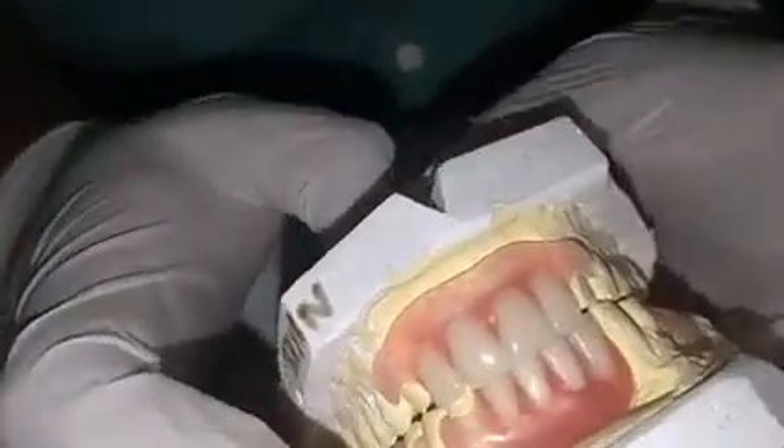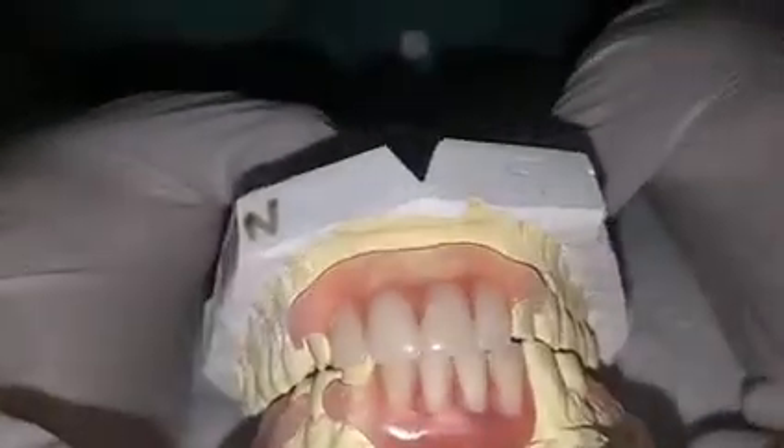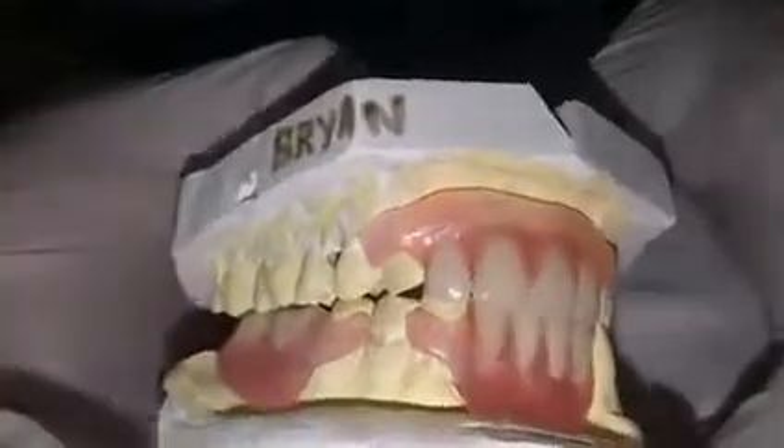You can see the occlusion as well — molars are on molars, anterior overbite is perfect, and the molars are occluding correctly all through. They have a good occlusion, they can bite well, and they can have a good smile. Thank you, have a good day, bye.